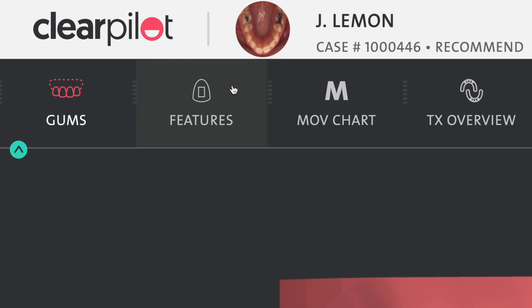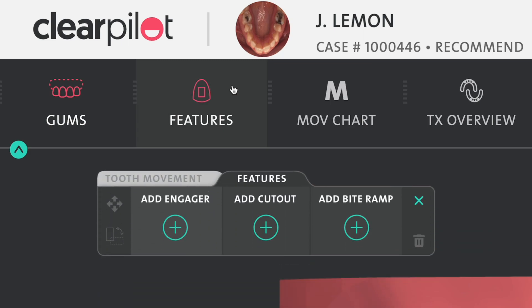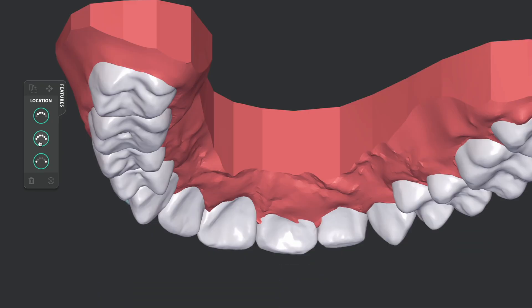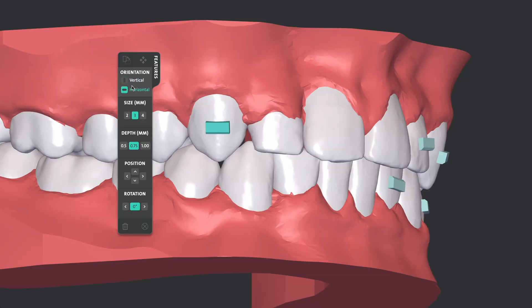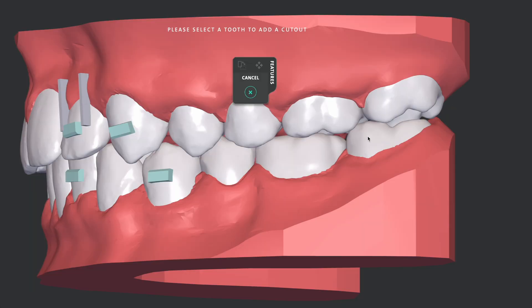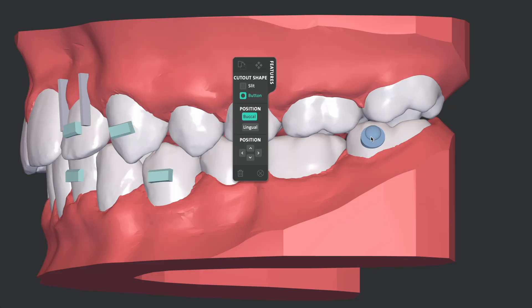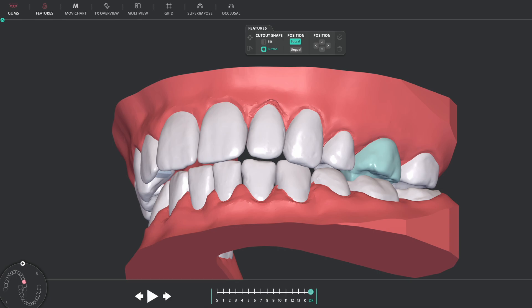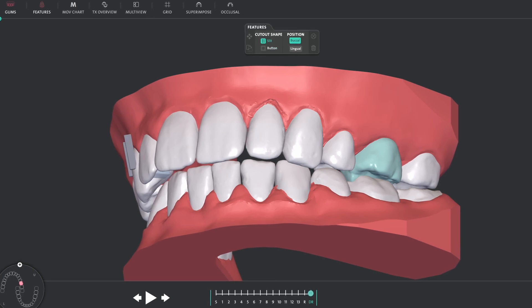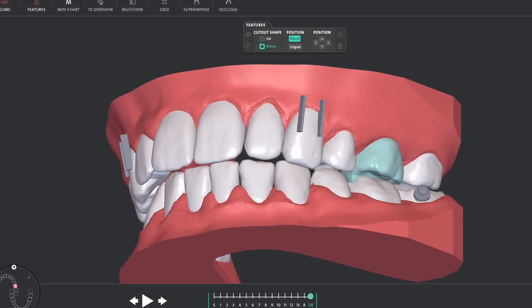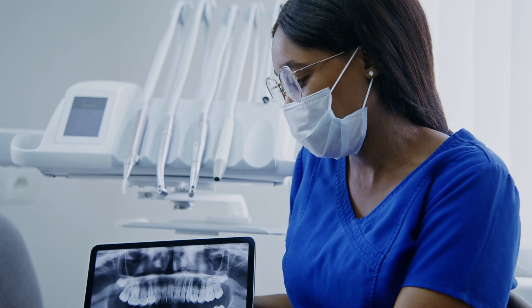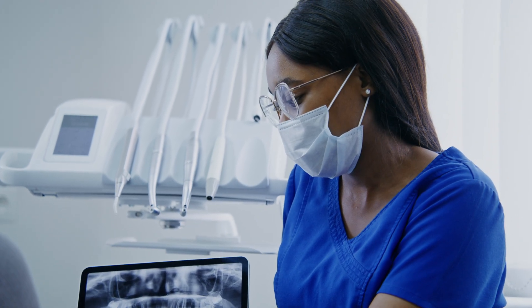You can even prescribe and place more advanced aligner features, such as bite ramps, engagers, and cutouts for elastics, that can expand your addressable indications to include class 2 and class 3 malocclusions, as well as deep bite and cross bite cases.